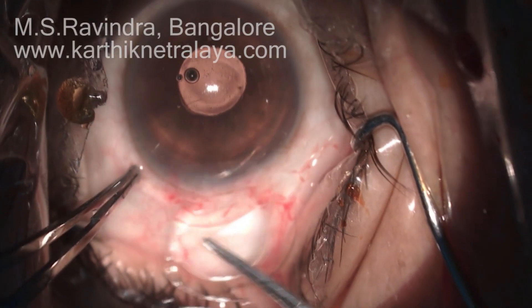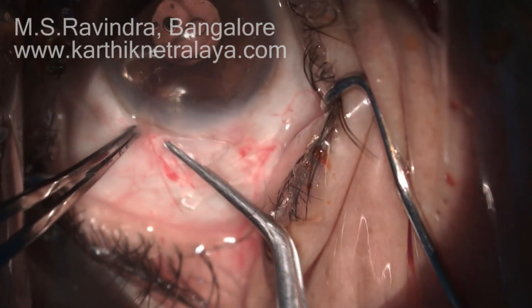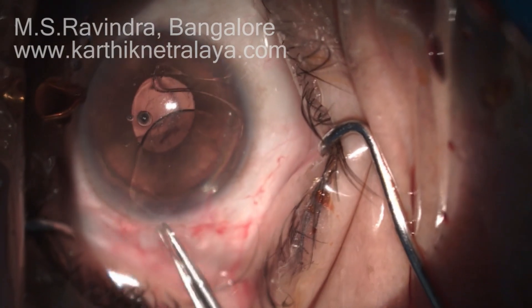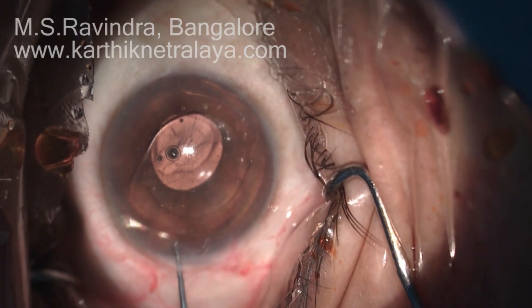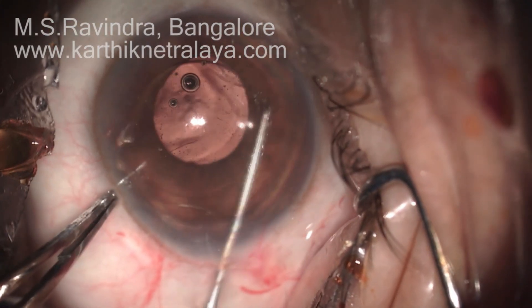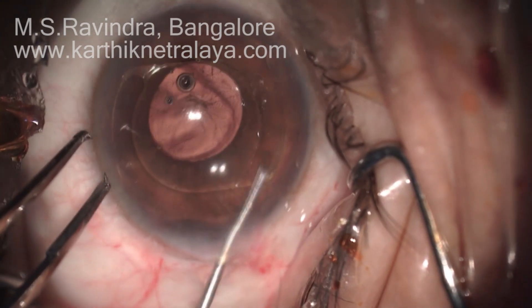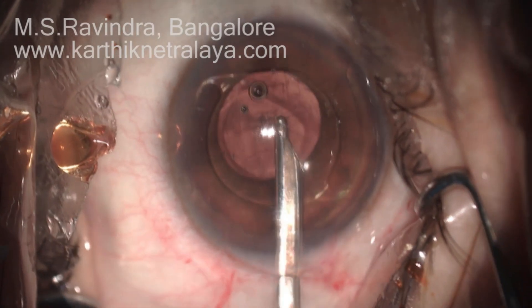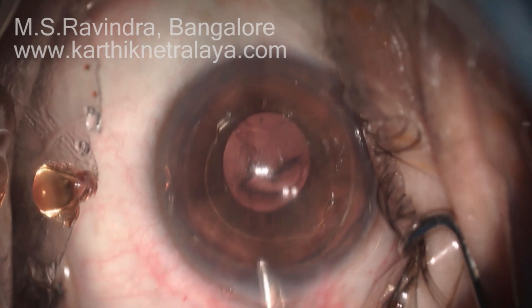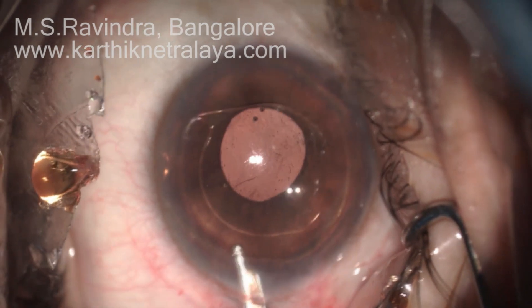The convexity of the haptic-optic should be anterior so that the haptics don't press on the angle region. The trailing haptic is positioned in the angle region, and viscoelastic in the anterior chamber is repeatedly infused, then completely aspirated. Vitrectomy can be done here if vitreous is present. Sizing is important — the pupil should be round and not peaked towards the haptics. By carefully planning the surgery, we can avoid endothelial damage, prolonged inflammation, UGH syndrome, and secondary glaucoma.